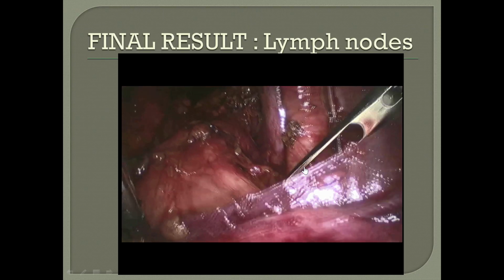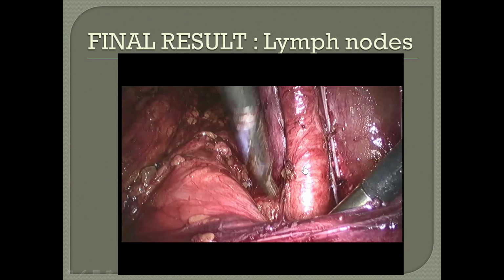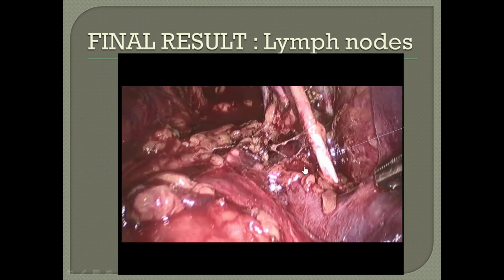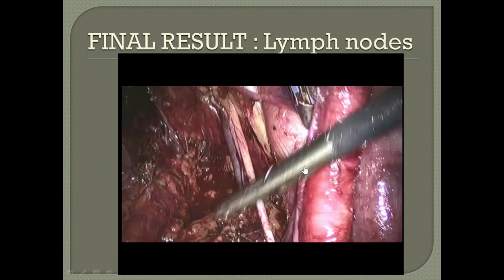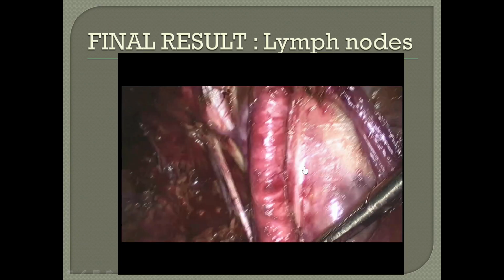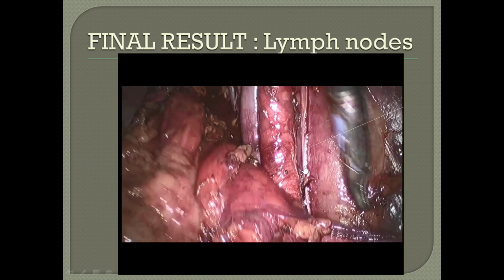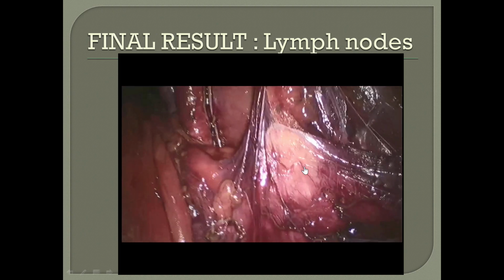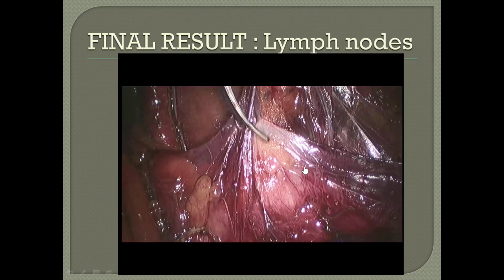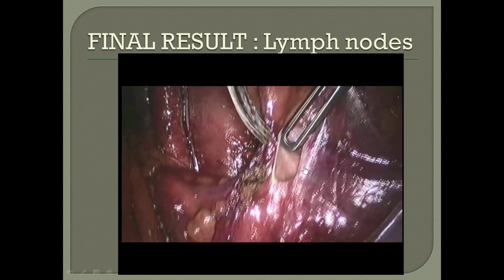Okay. Sometimes I have to do a lymph node dissection. I will do exactly the extraperitoneal approach, like this. But at the end, to avoid lymphocele, because we have more lymphocele by the retroperitoneal access, you have to open widely the peritoneum on both sides to create a preventive marsupialization. You see here, I will open the peritoneum. Here I open it to prevent the lymphocele.